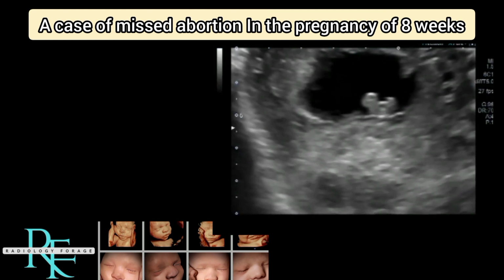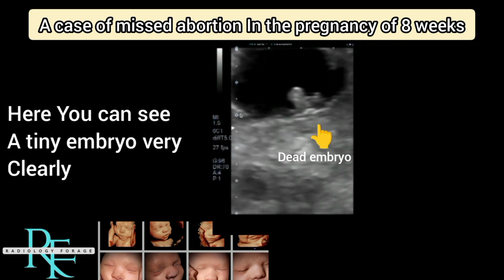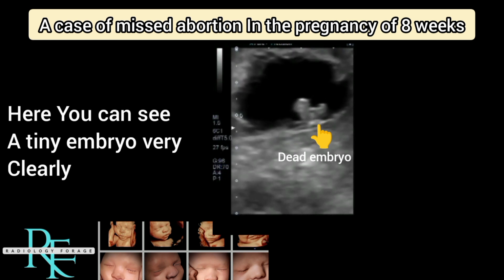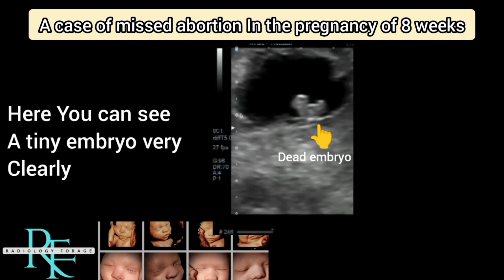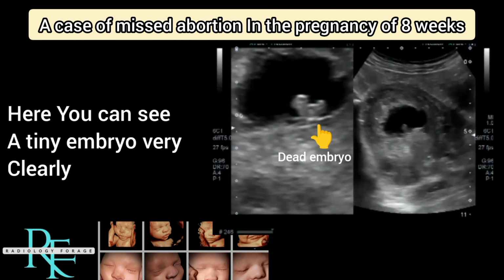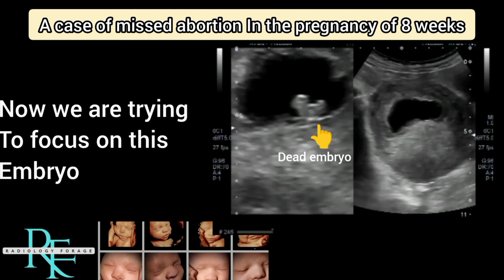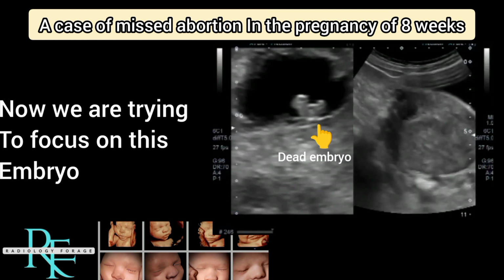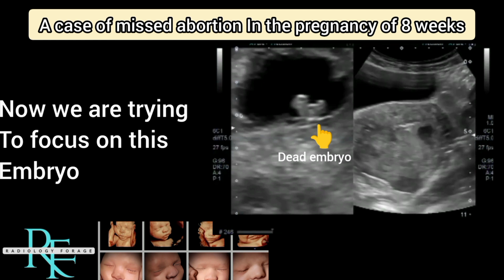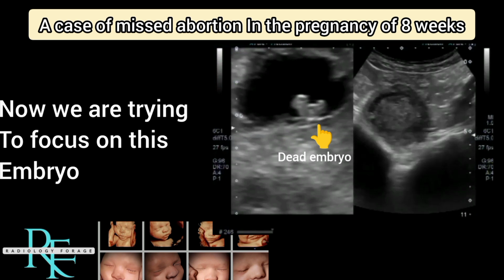This is a tiny embryo and this is a dead embryo. Now we are looking for a tiny embryo and this is a gestational sac and there is no cardiac activity seen. Now we are trying to focus on this embryo. This is gestational sac and this is a small embryo which is dead.